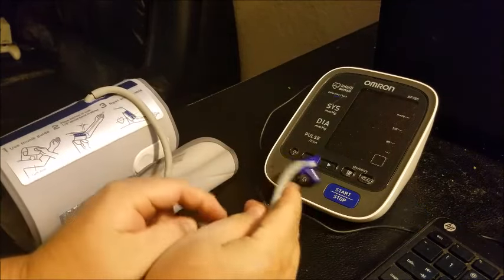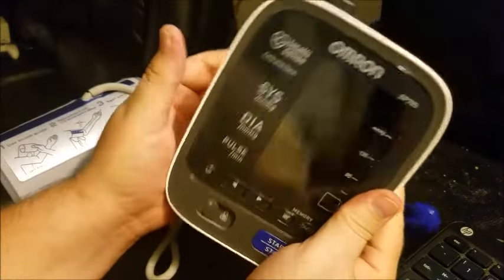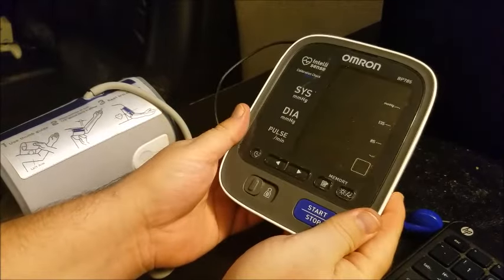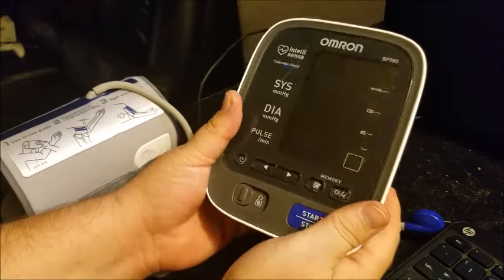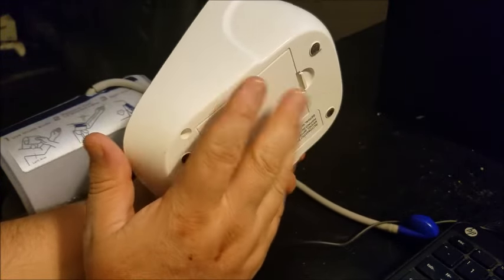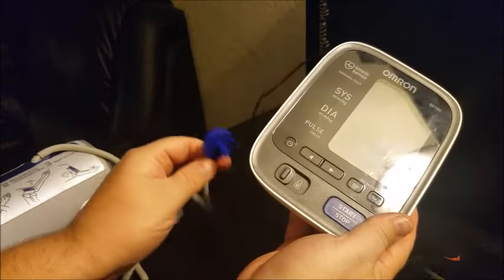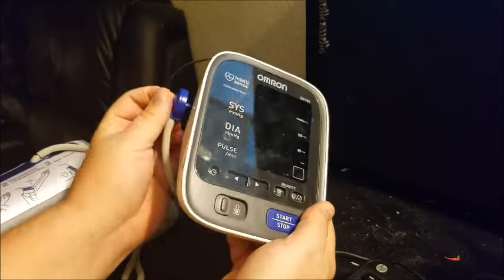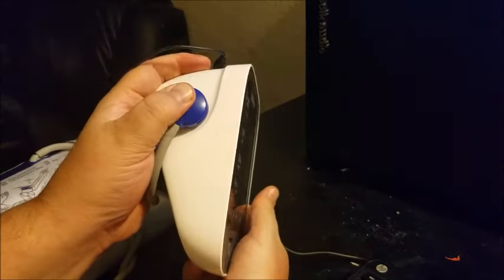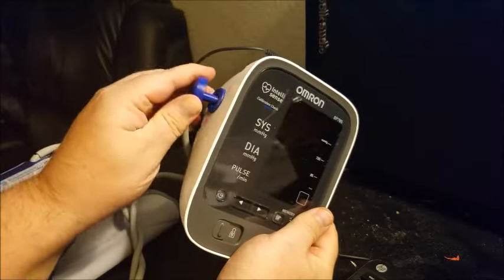But there are three things you need to check. First, if you have a power cord and it's plugged in by electric, that's preferable as opposed to batteries. If you do have batteries in, that could be an issue where the batteries are getting weak and you need to change them. Second, you'll want to make sure the cuff connection is in very well, because that could be causing your error if it's not making full contact.